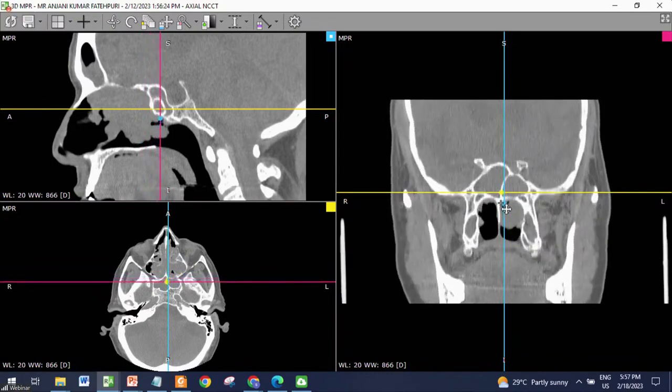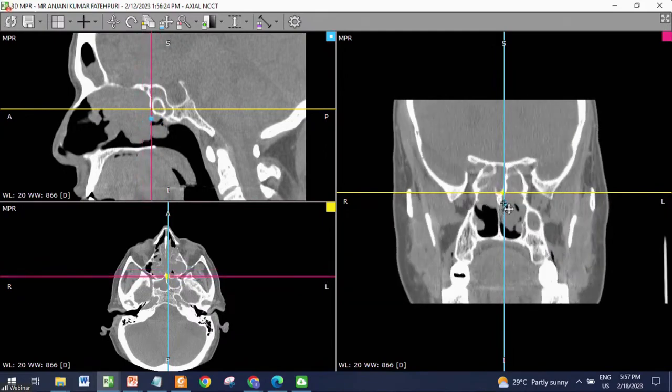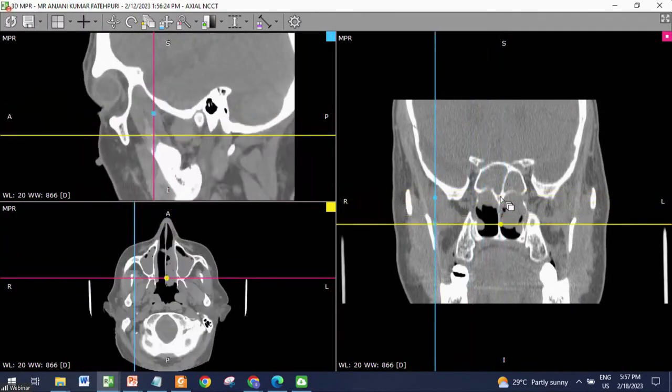And you see, this is the level of the posterior septum. See, posterior septum, here the rostrum forms. And here close to the rostrum, see this, close to the rostrum, you have to enter into the sphenoid. Just along the septum. That is the best way. You cannot disorient if you go along the septum.